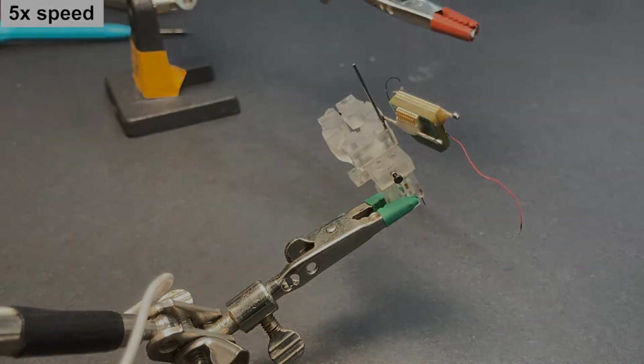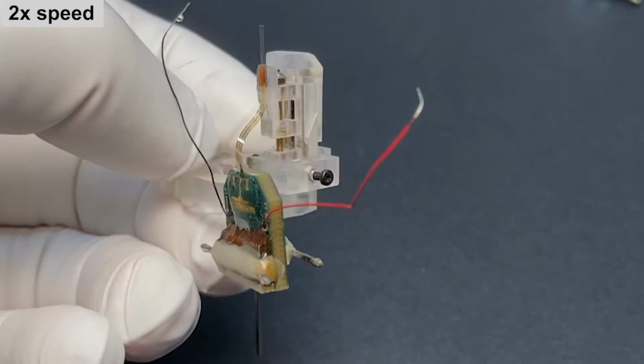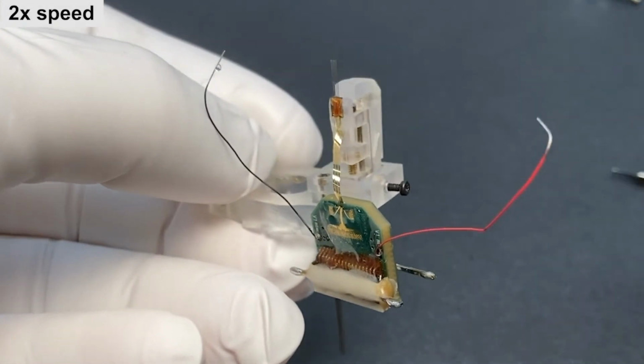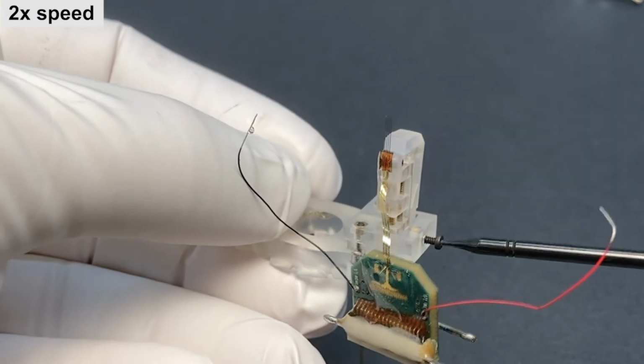And as a final step, please make sure you don't apply any tension on the flexible cable, and you can align and secure the drive again. So now I am holding this stereotactic holder. I can loosen the screw, realign the drive, and then secure again the whole drive with this screw.